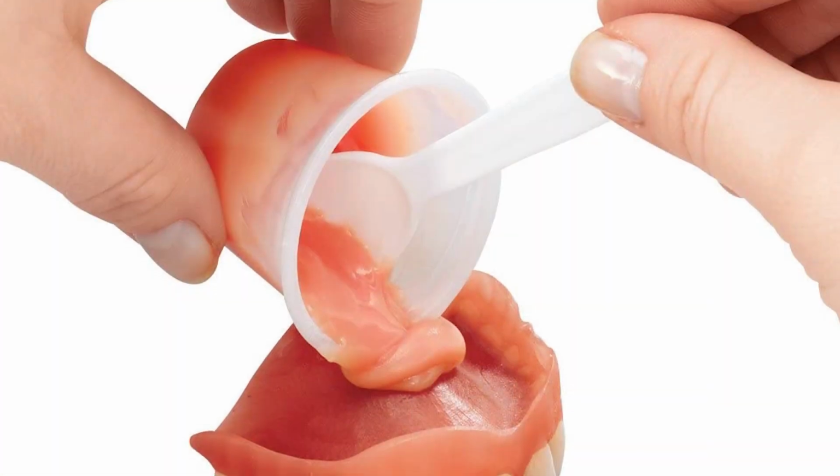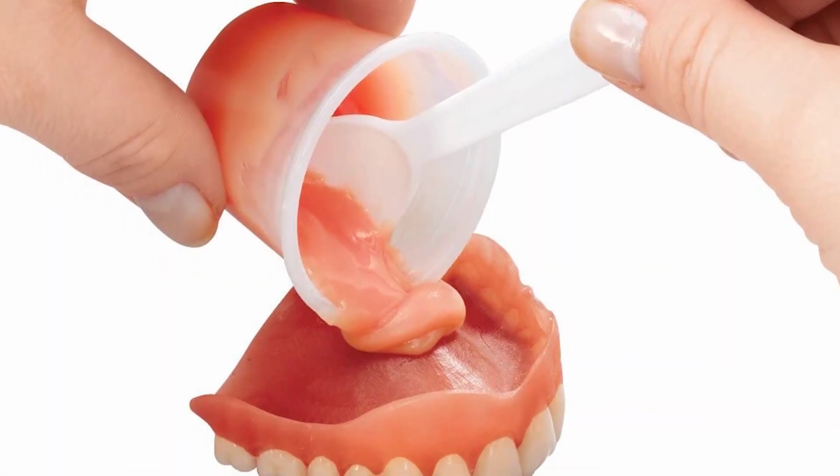One way that you combat this is that you reline that denture over time. So you change the inside of it to fit the gums. Well, that works for a while until the bone shrinks more, and then you've got to do that again. But the problem here is that the denture gets thicker and thicker as time goes on, and it fits less and less well. So really we need to get at the root cause of this and use implants. We can't use teeth anymore, but we certainly can use implants to help maintain that bone so that it doesn't keep going away. The only real upside to a denture is that it doesn't cost very much.